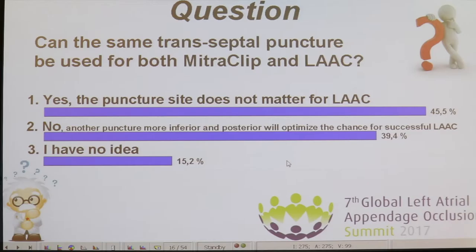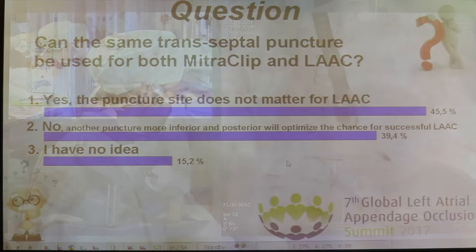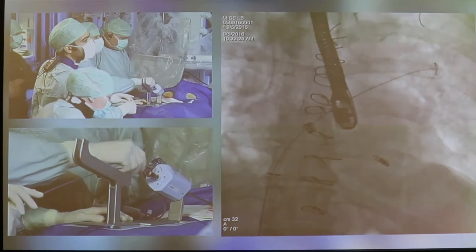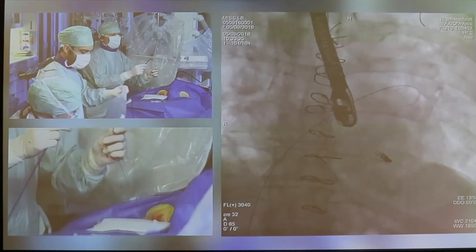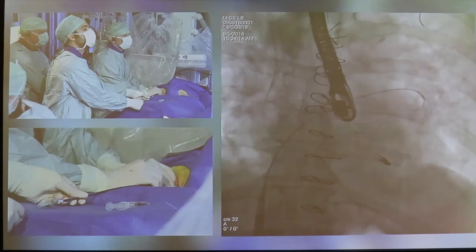Almost half of you think it doesn't matter and you can continue. What we're going to do is take out the MitraClip delivery system and replace it with an 18 French Cook sheath. We bring in a stiff wire going to the left atrium, then advance the 45-45 delivery sheath of the Amulet. There should not be a lot of resistance crossing the interatrial septum because a much bigger system has already been across.